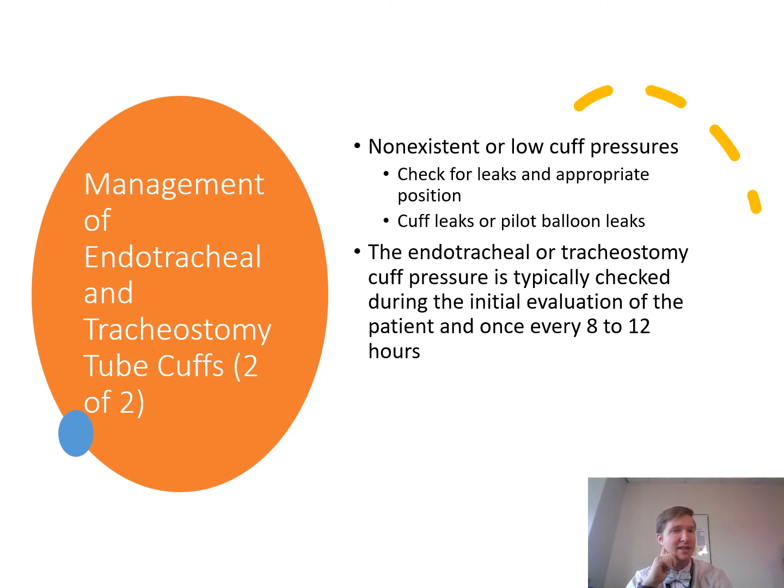An accidental cut in the pilot balloon is common, right? It can happen. It usually happens when people have taped to secure the ET tube. The problem can be remedied pretty easily by positioning a 3-way stopcock between a blunt-tipped needle, inserted into the cut pilot balloon, and a syringe. Some manufacturers have a blunt-tipped needle device with pilot balloons, so there are repair kits out there. The blunt-tip needle can be inserted into a cut pilot balloon, and the cuff of the ET tube can be reinflated.